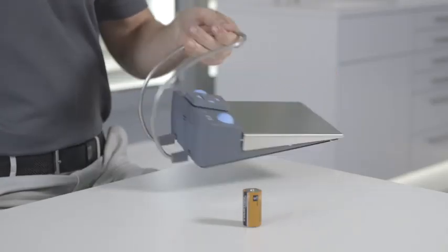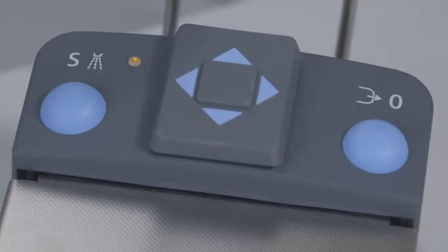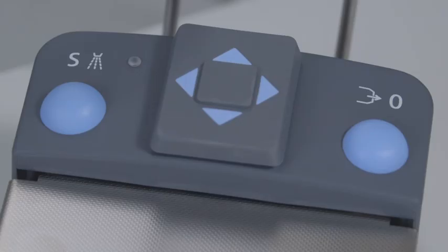After inserting the battery, pay attention to the status of the LED. The yellow LED on the foot control indicates the battery charge level after the battery is inserted. If the LED lights up for approximately 10 seconds after insertion without flashing, the battery is okay. If the LED flashes after insertion, the battery is too weak. Please insert a charged battery. If the LED does not light up after insertion, the battery is dead and must be replaced.